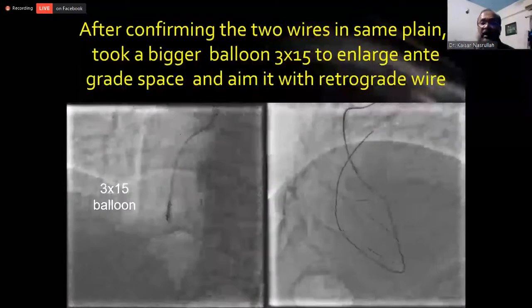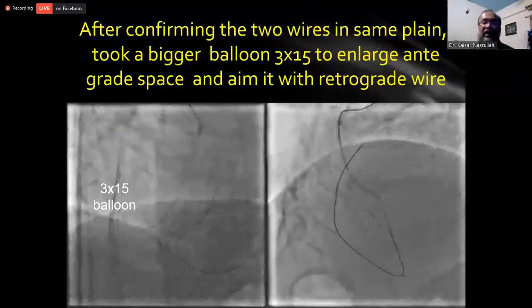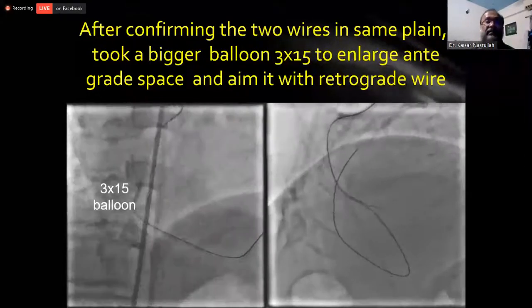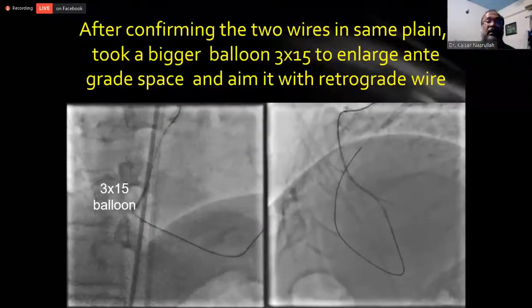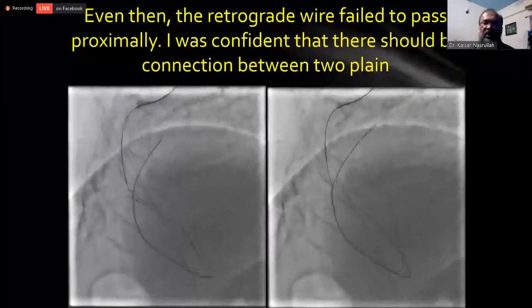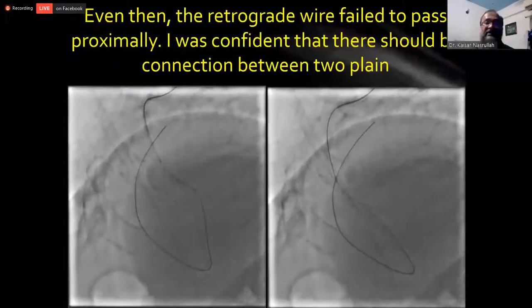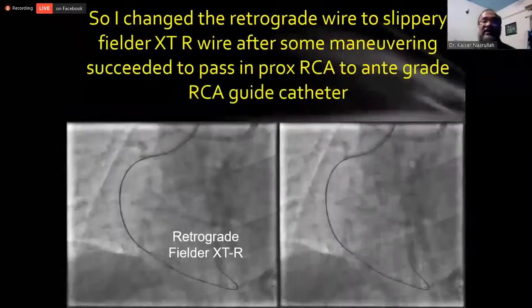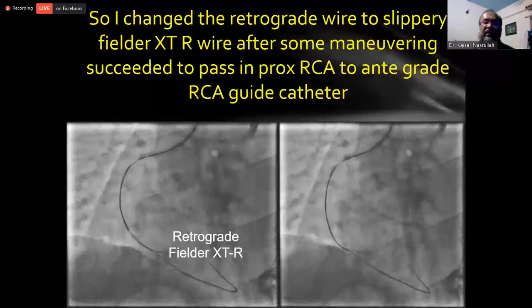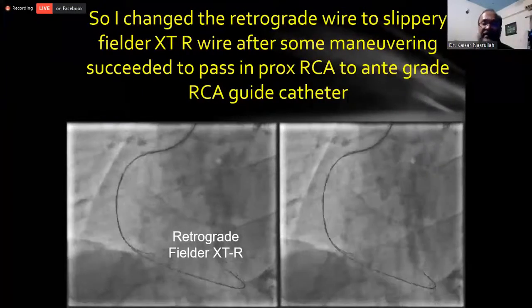After confirming the two were in the same plane, I took a bigger balloon, 3 by 15, to enlarge the antegrade space and aim it with the retrograde wire. Even then, the retrograde wire failed to pass proximally, but I was confident that there should be a connection between the two planes. So I stepped down and changed to a slippery Fielder XTR wire. After some maneuvering, I succeeded in passing into the proximal RCA to the antegrade RCA guide catheter.